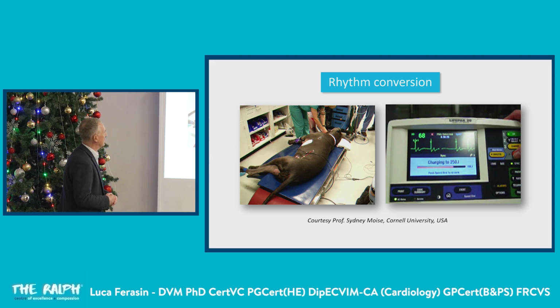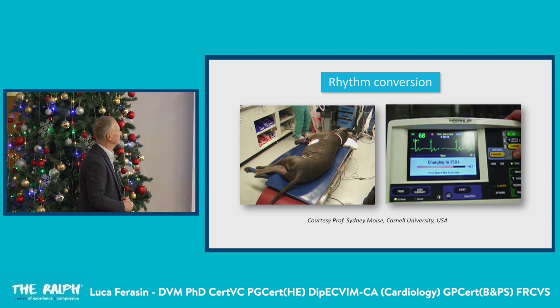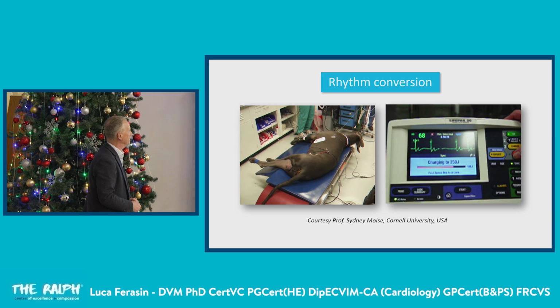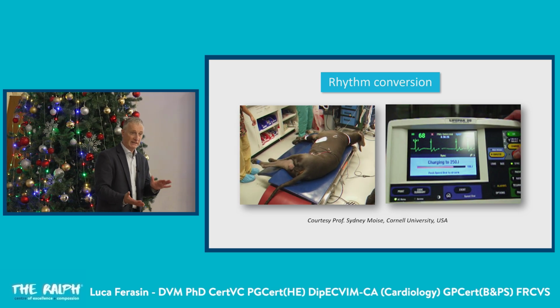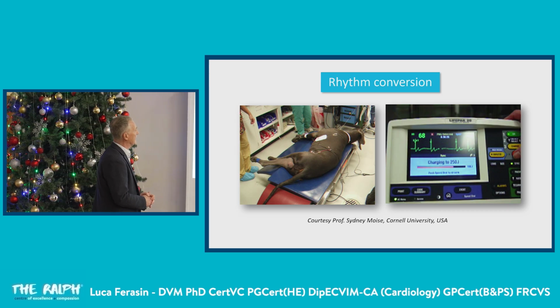So general anesthesia, and then this dog will receive an electroshock. It's quite brutal, as I said. All right, just empty. I'm not doing anything so you get clear. Okay, everybody clear, here goes. Right? They literally jump off the table, because of the muscle contractions that are associated.